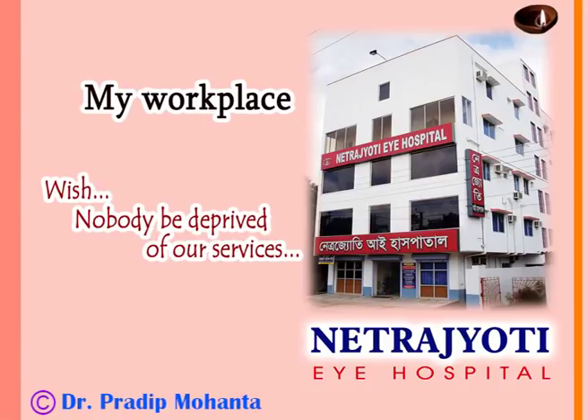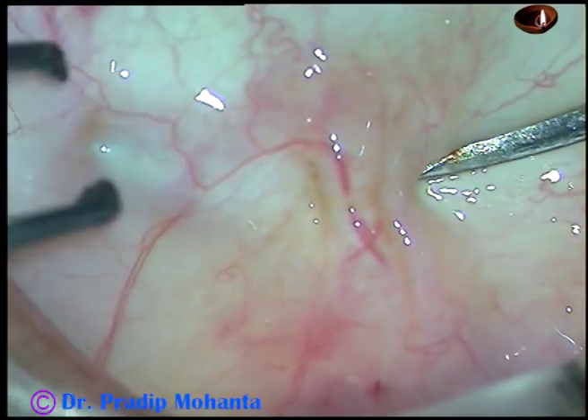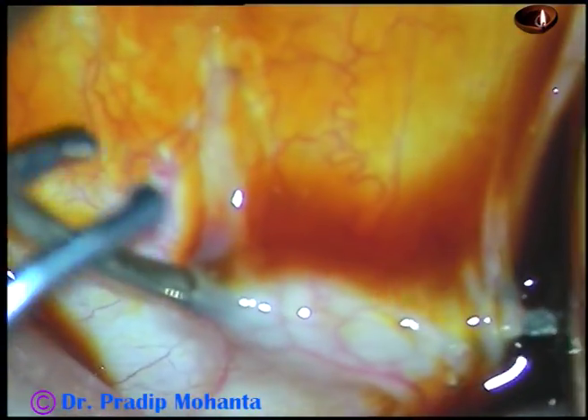Dear colleagues, welcome to my hospital at Ranaghat, West Bengal, India. This is a mature senile cataract and in this case I have planned extra capsular cataract extraction with a rigid IOL implantation.